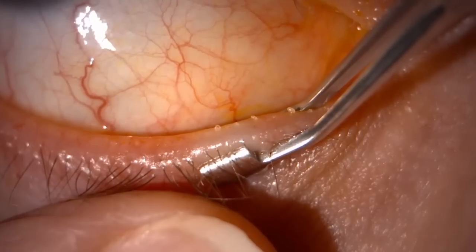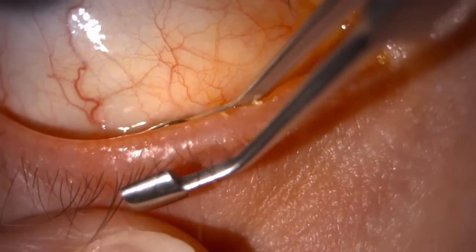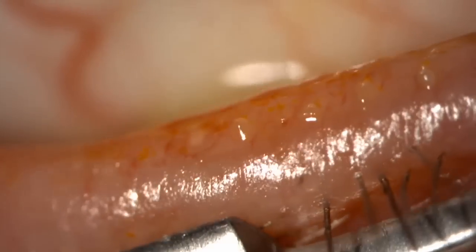You work your way along the lid edge and the lid margin, squeezing the glands with each section. It is important to try to express every gland thoroughly, making sure the patient isn't too uncomfortable as you keep guiding the forceps along the margin of the lid.